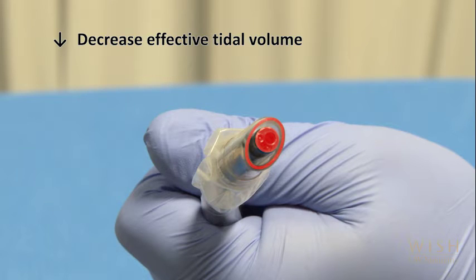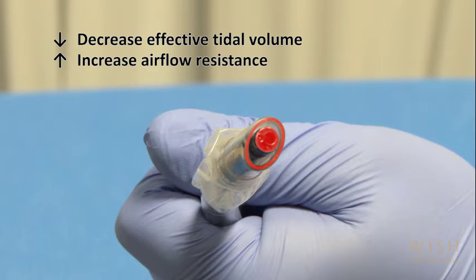This will reduce the effective tidal volume administered by the ventilator during bronchoscopy. The upper airway narrowing caused by the bronchoscope will also increase airflow resistance during the expiratory phase. This can result in increased intrathoracic pressure from incompletely exhaled tidal volumes. On the other hand, positive end expiratory pressure, or PEEP, which may be essential for adequate oxygenation, can be eliminated by vigorous bronchoscopic suctioning, which would then result in desaturation. This also should be avoided.